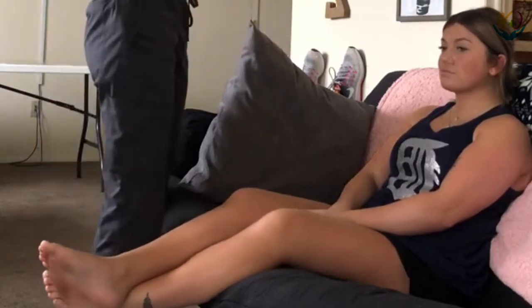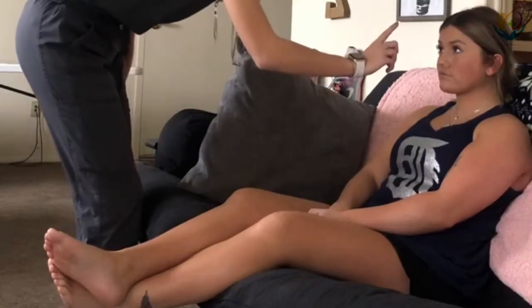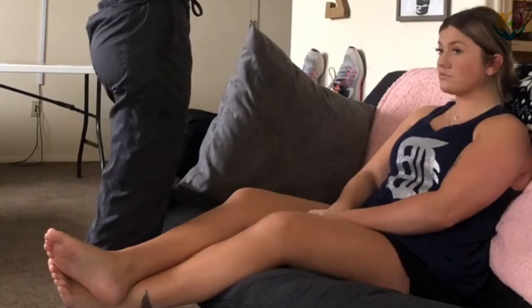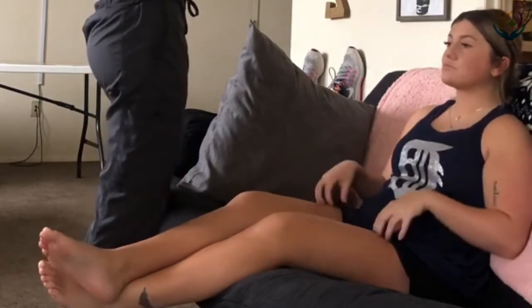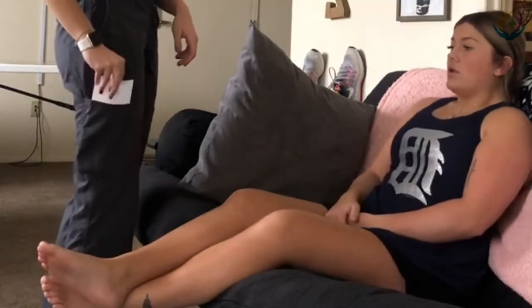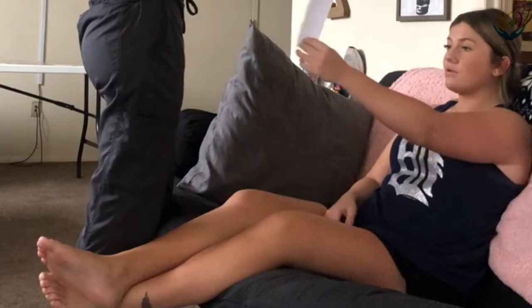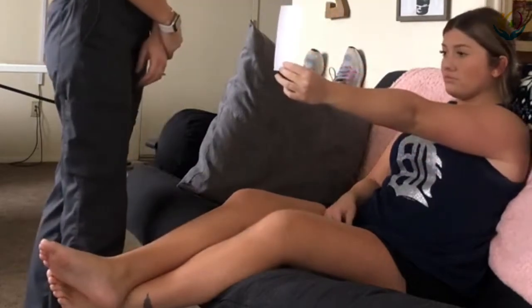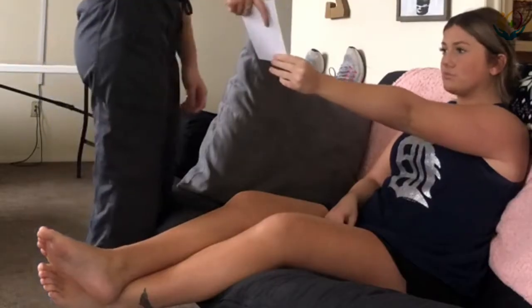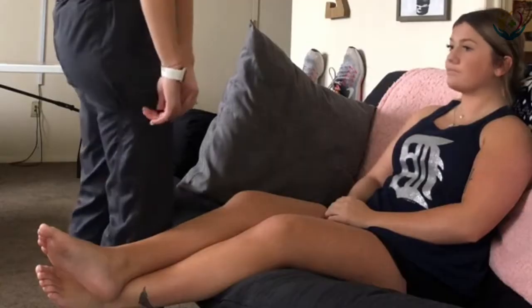Alright, and now next I'm going to ask you to look straight ahead, and I'll focus in on my finger. Okay, pupils do react to light and do accommodate, so pupils are equal, round, reactive to light, and accommodation. And now I'm going to pull out this Snellen chart out of my pocket to assess your vision. So if you can hold this straight out in front of you and repeat the smallest line that you can see. LDCZOTE. Okay, and that is 20/20 vision, and you're not wearing contacts and you don't wear glasses, correct?